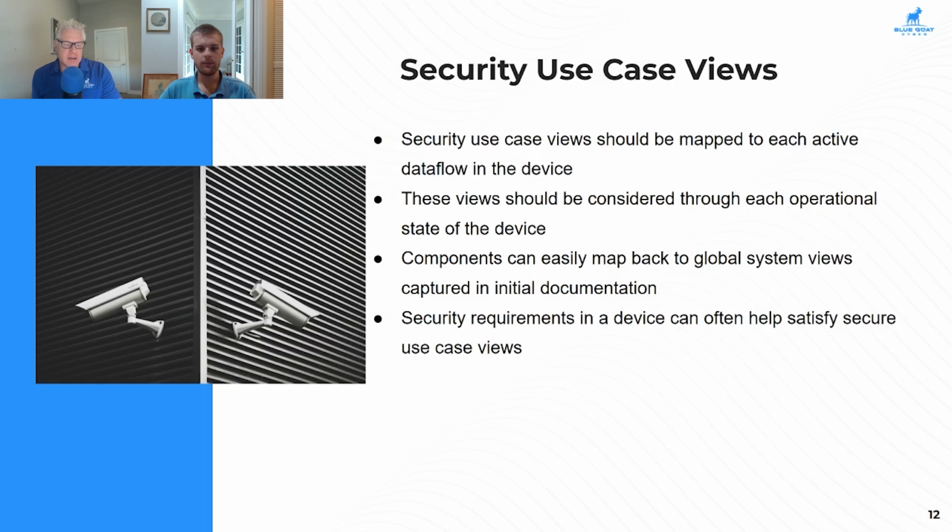So one of the things I hear you talk about quite a bit, I know it's been an attack we've been able to pull off, is like a DICOM image. So that would be the data flow. If I have a system that ingests DICOM images, it has some AI component that does some analysis and image enhancement, and then sends a DICOM image back out to somebody else to look at, that's the data flow. And what controls will we need to have on that data flow to prevent things like a bogus DICOM image from being ingested in that system and bogus output?